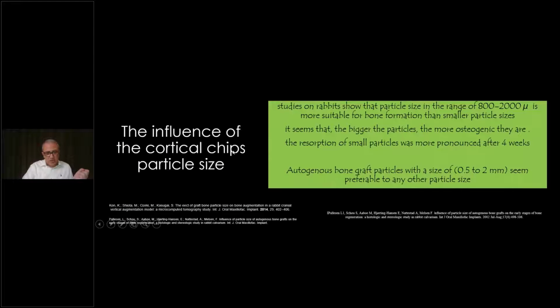What is the size of the chips? You really need not to go less than 0.5 millimeters, and you need not to go over 2 millimeters, because it has been studied in rabbits, and we found out that the average size should vary from 0.5 to 2 millimeters. That is seen to be preferred.